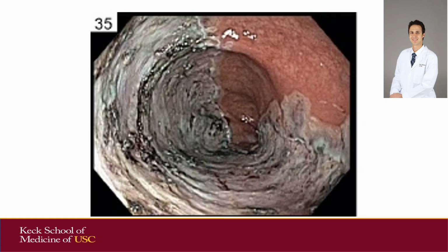We can see here that the entire lesion was removed in en bloc fashion, and the final histology did show foci of intramucosal carcinoma. This was considered a curative resection. It was also notable that this lesion came down to the anal verge, and ESD can be very useful in such situations.